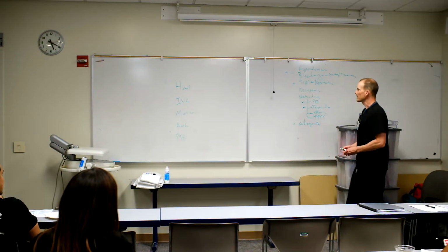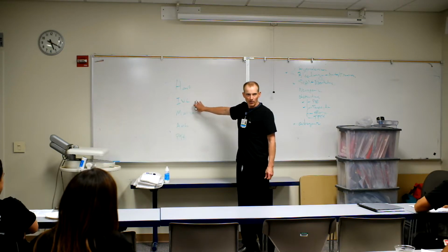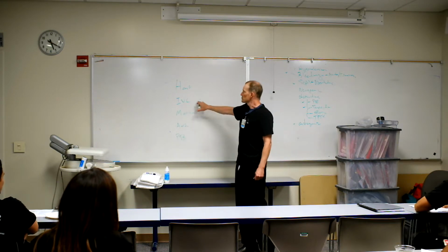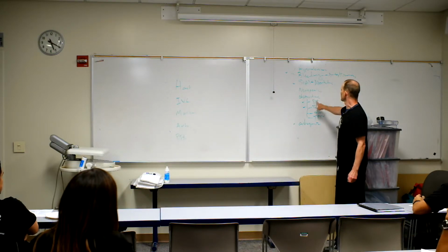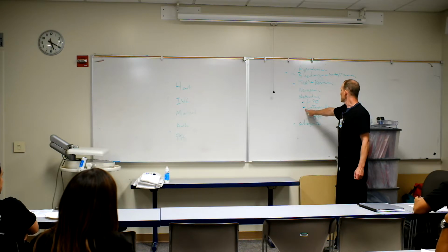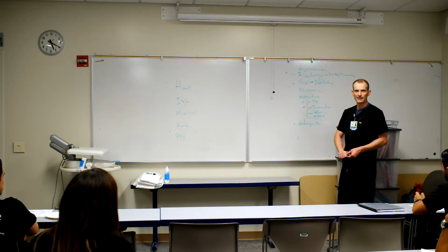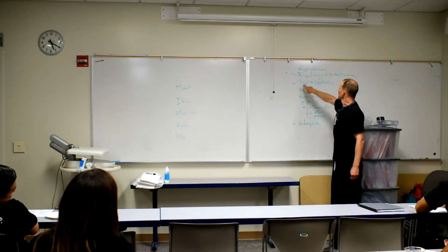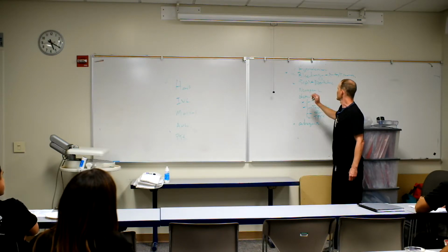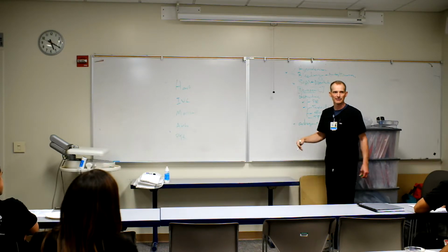Okay, so then we move on to the IVC. The IVC is going to be big, small, or normal, right? If it's normal, it doesn't help you out. If it's super big, then you're thinking that we could be dealing with a PE, a tamponade, tension pneumothorax, or effusions, or a cardiogenic shock, right? If it's small, then we're dealing with hypovolemia, bleeding, sepsis. This neurogenic thing, this is going to be your C-spine, spinal trauma patients. Everyone's not going to get fooled with that, right?